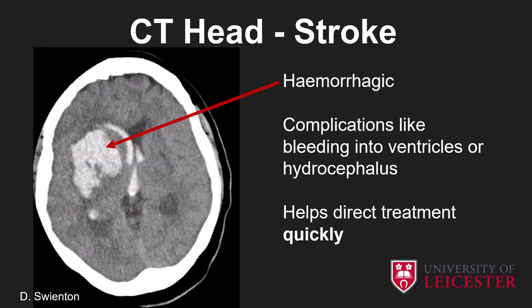Moving on to stroke, which forms about 30% of the scans we do in ED. This is a hemorrhagic stroke, typically associated with hypertension, centred on the basal ganglia. We can see the bleed — blood shows up very well on CT — but we can also assess for complications. Here you can see blood has extended into the ventricular system; this patient will be at risk of hydrocephalus. Ventricular dimensions are very easy to see on CT. The real strength of CT, particularly in stroke imaging, is it helps direct treatment quickly — you get a very quick real-time decision with the aid of CT.